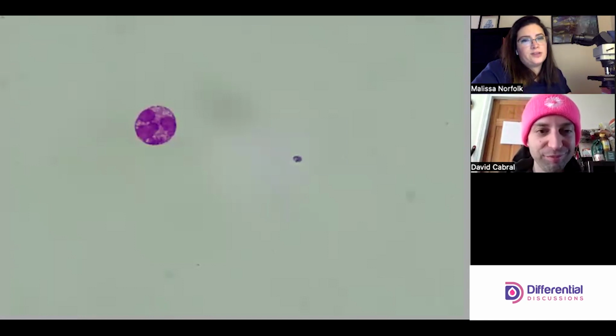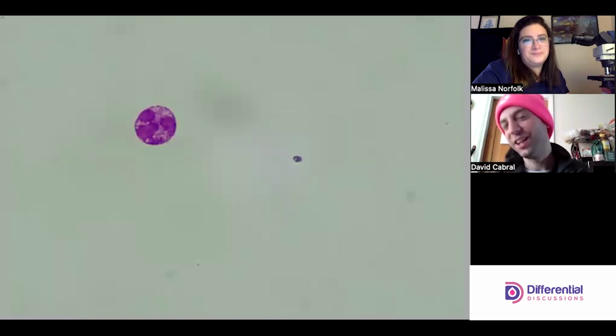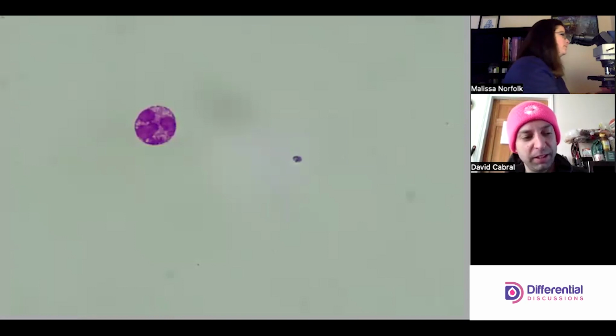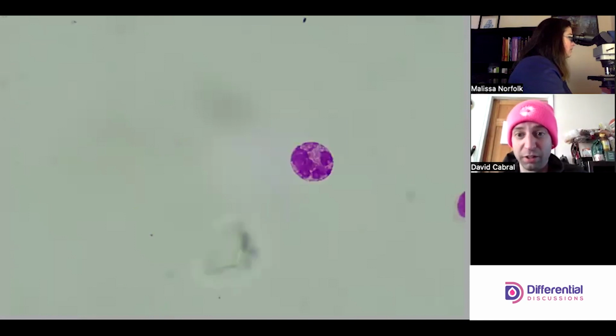I think the coloration of the cytoplasm is also off for a neutrophil. It's way more of a darker purple color. You are dead correct. When I talk about basophil color of cytoplasm, it's tough because it's really subtle, and I think you need a lot of time with these cells. But yeah, you are 100% right. It's purpley, whereas we think about a neutrophil to have a pink with purple or lilac granules. There's another one.